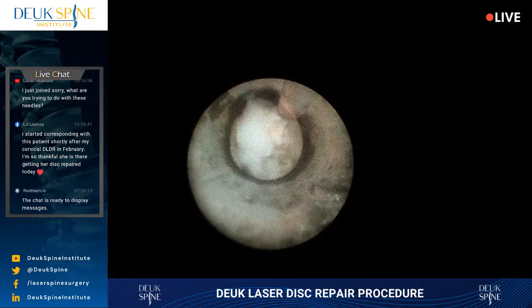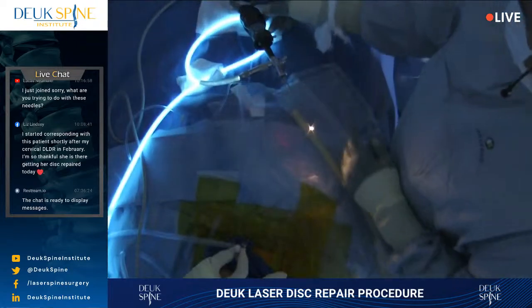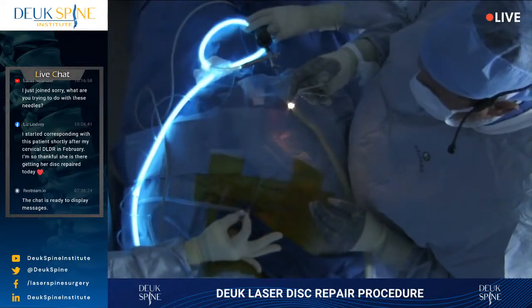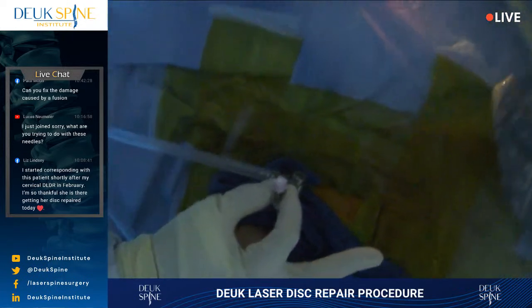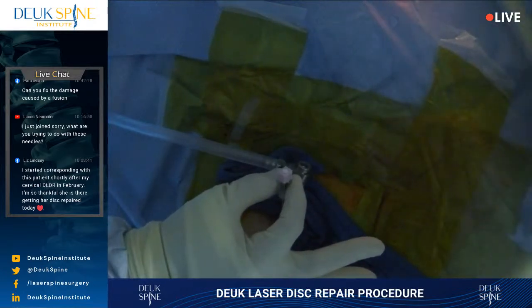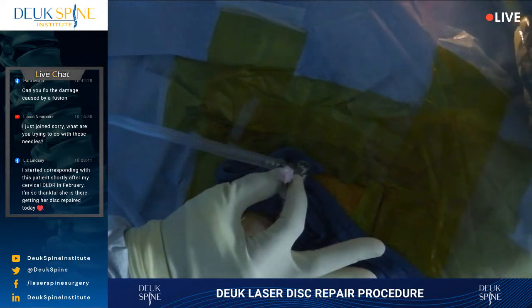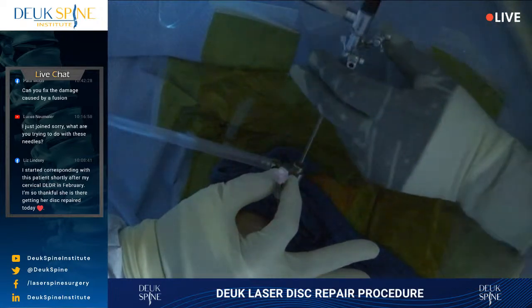Gosh, look at all these pieces of herniation. So lasering them is going to be very inefficient to zap them away and debulk them. You'll be here for hours. That's not good for the patient. So it's better to go in and grab them out when you can. Some herniations are stuck to the annular tear, others are not. I don't know if I got anything, but it's a little hard to tell. Either way, we have to go back in.